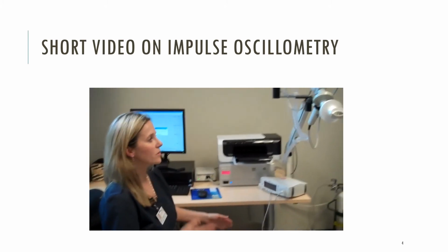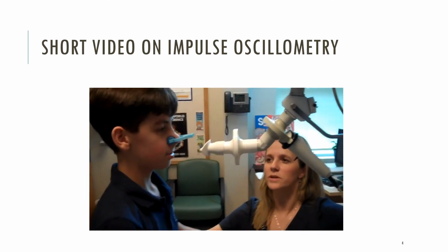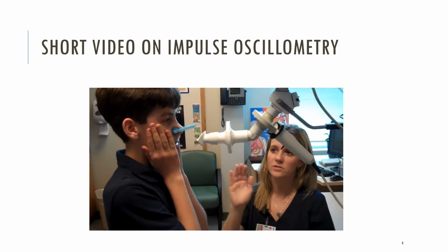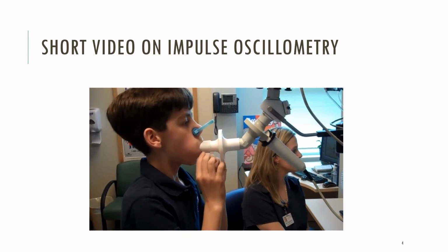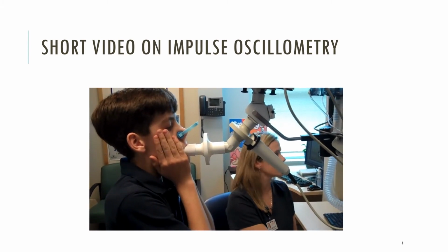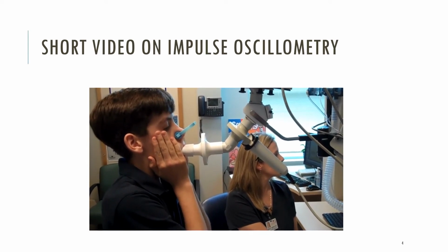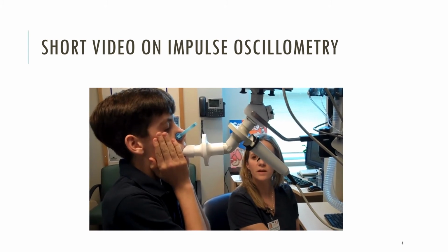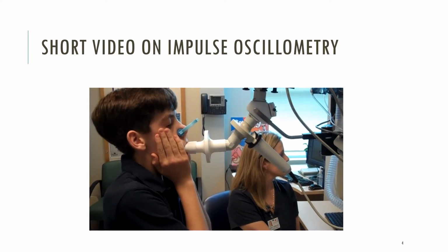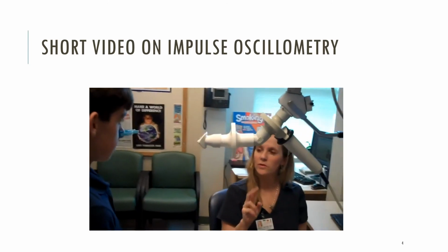So I'd like to show you here with our young patient how easy this test is. Can you come stand over here? Now I want you to place your hands on your cheeks and just breathe in and out, nice and easy, just very gentle. Go ahead and get your mouth on the mouthpiece. Put your hands up on your cheeks and just relax. Just breathe in and out. Doing a good job. Just relax. You're almost finished. You're going to feel a little bit of that air going in and out through your lungs there. Very, very good. Okay, you can come off. We'll do about 2 more of those and then you'll be finished.